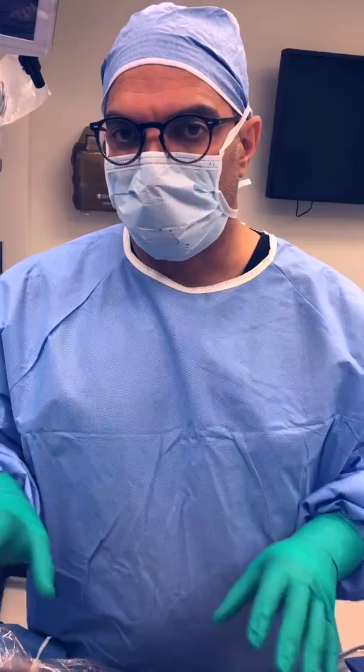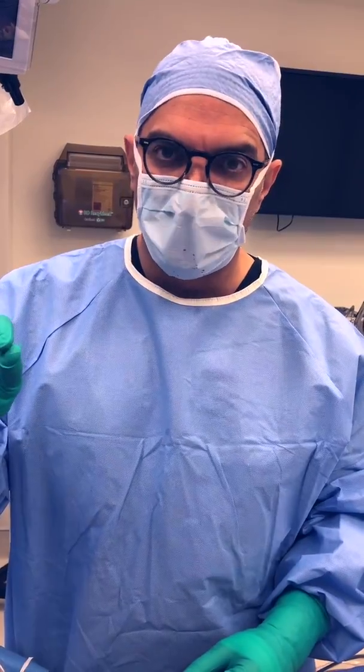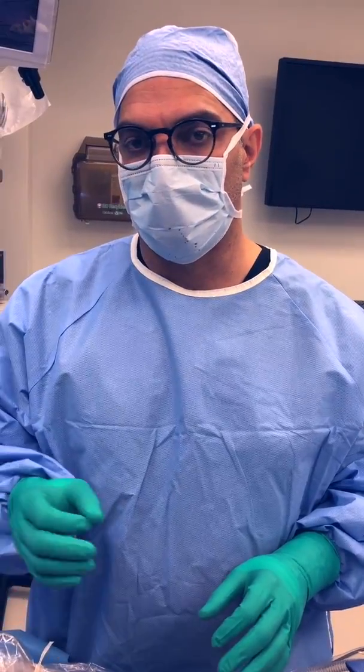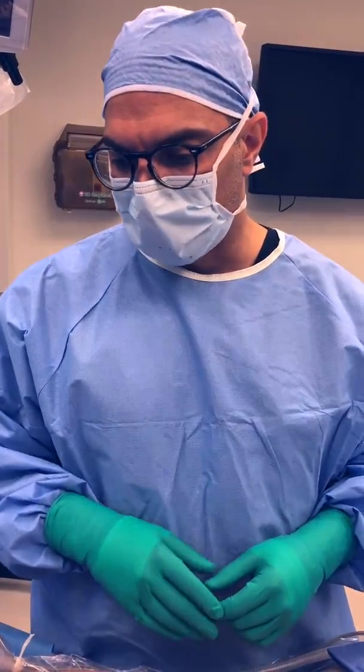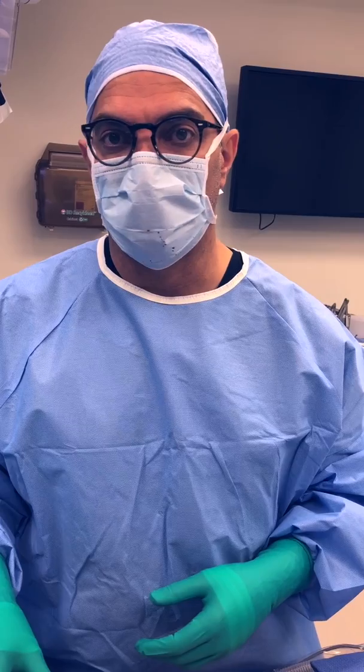The take-home message with electro desiccation for neurofibromatosis is to get in early. These bumps start out small and will grow either rapidly or slowly over time, and if you can address them with electro desiccation early you can treat a large area in one session. This patient had it on her front and back surface, and we were able to do both sides because the tumors were small enough for electro desiccation to cover the majority of the treatment. Get evaluated early, and if electro desiccation is indicated, pursue it early.